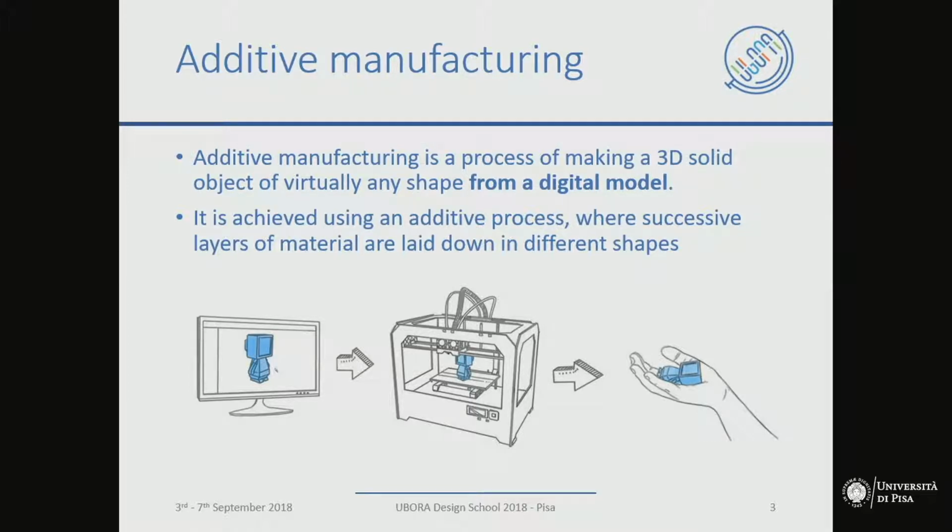Now, this concept is known as 3D printing. We are engineers, we prefer to say additive manufacturing. 3D printing is for laymen. When you talk with journalists, you can say 3D printing. When you talk with professionals, prefer to say additive manufacturing, because 3D printing is a specific technology in additive manufacturing.